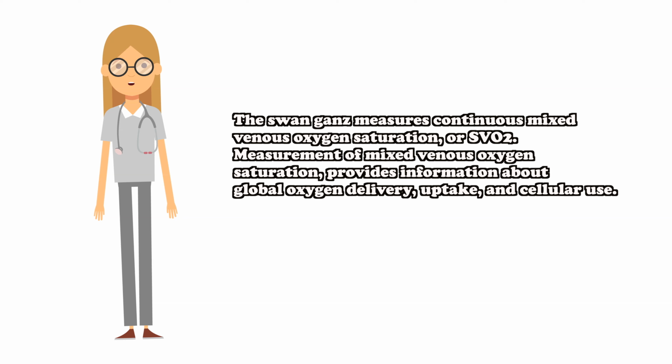The Swan Ganz measures continuous mixed venous oxygen saturation, or SVO2. Measurement of mixed venous oxygen saturation provides information about global oxygen delivery, uptake, and cellular use.